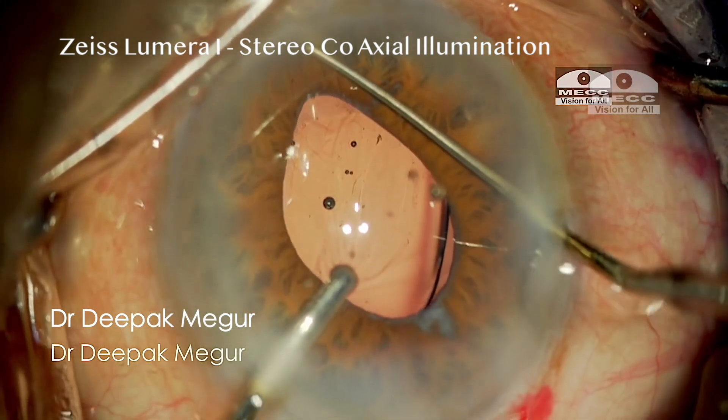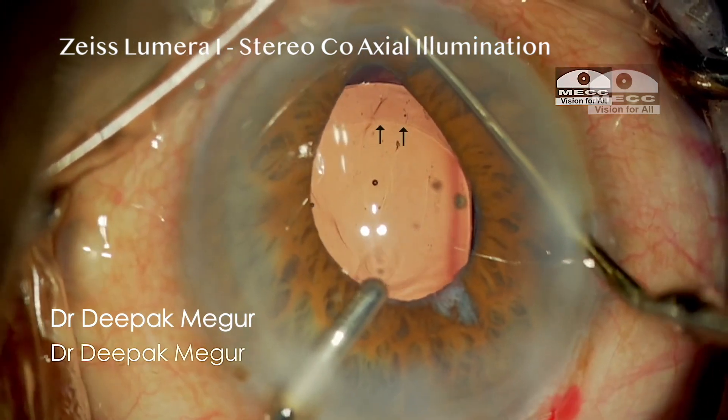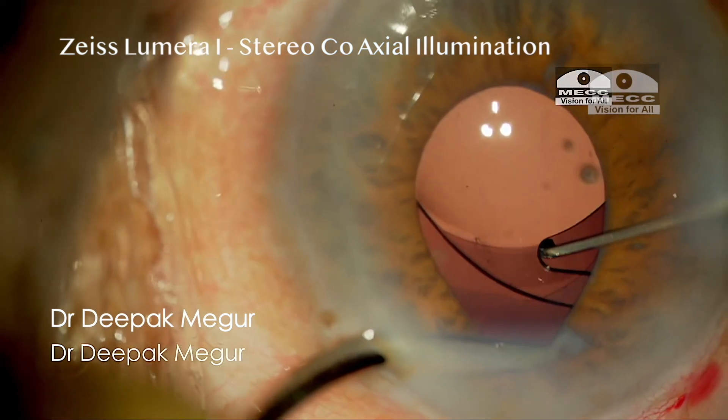The only downside of these microscopes is the cost, which makes them unaffordable for a large number of surgeons.